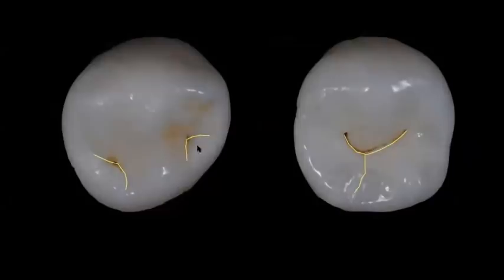We're talking about, okay, I understand the anatomy of the first mandibular premolar, the second mandibular premolar, the different types of premolars that we have in the mandible, the H type, the U type, the Y type, so that we know which one I'm going to select to reproduce in this particular tooth. If it's an occlusal restoration, well, the occlusal anatomy should give you exactly what you need to do. If it's a more complex type of restoration where you need to replace a cusp, well, now you can become creative.